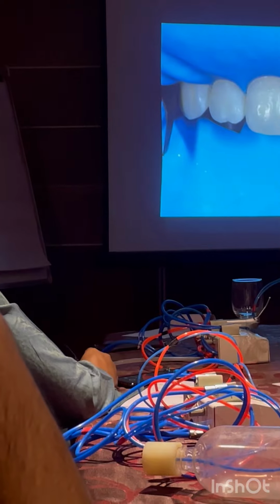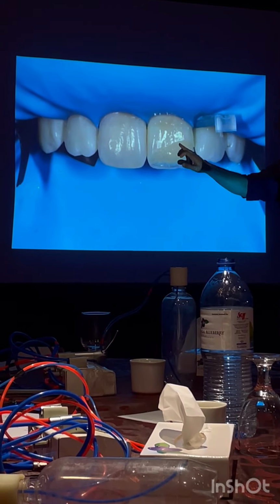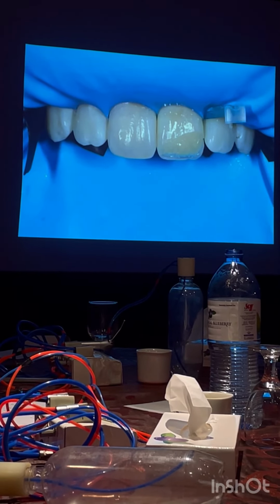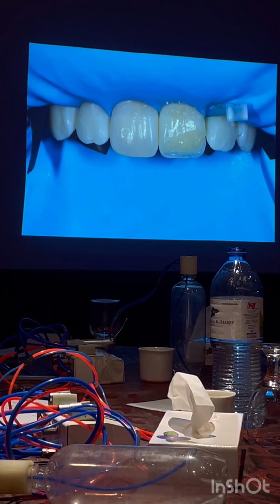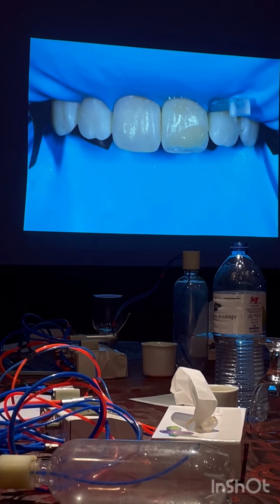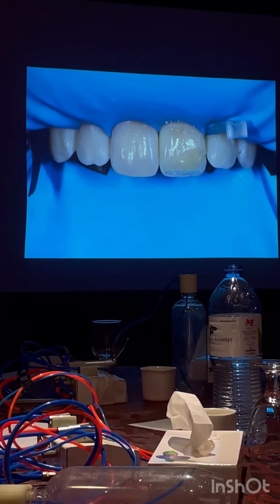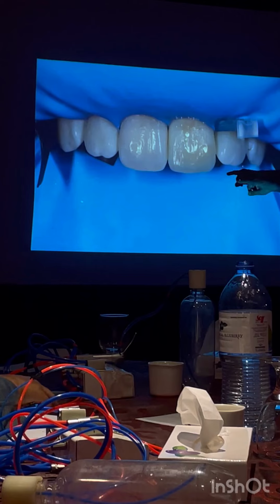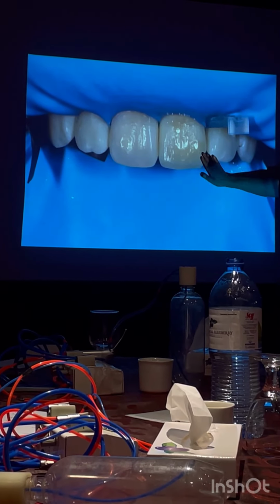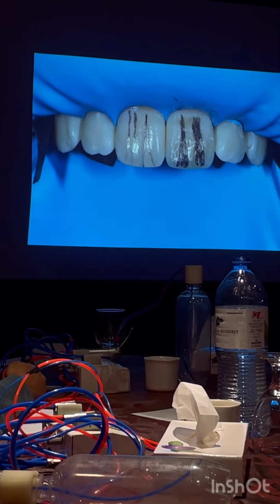Once I cure this completely, I will place my body. Can you see my body? Yes. It is variable. It is thick here, and as I come down, I reduce the thickness. Please follow this in every procedure you do. You have to vary the thickness, whether it is a veneer or a class 4 or a class 3. Okay? And then I give my lobes. Once I give my lobes, the mamelons, then I place my final enamel. I merge it nicely beyond the bevel, and now I mark my textures after finishing.